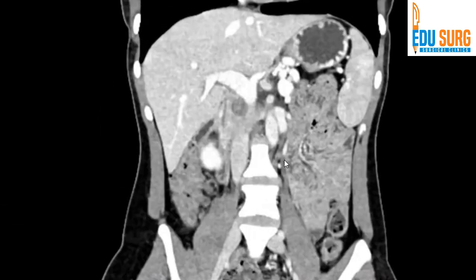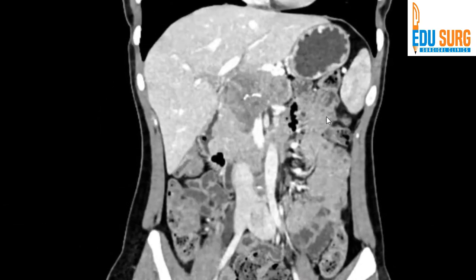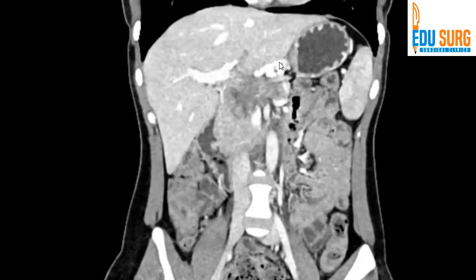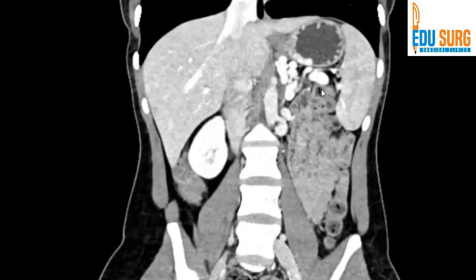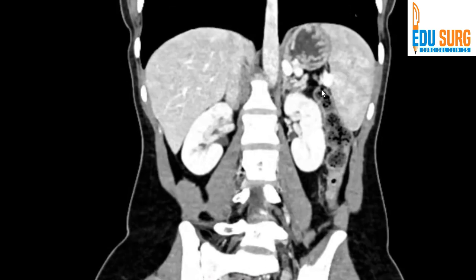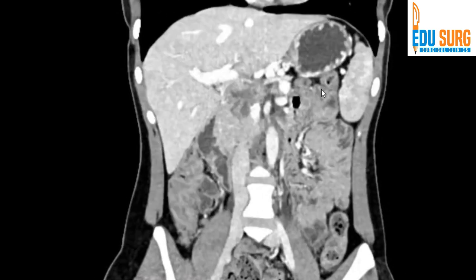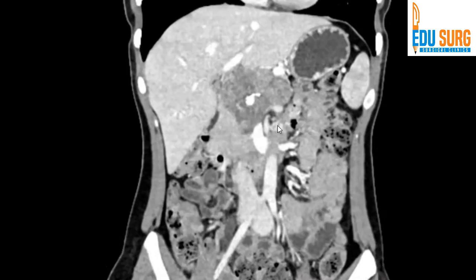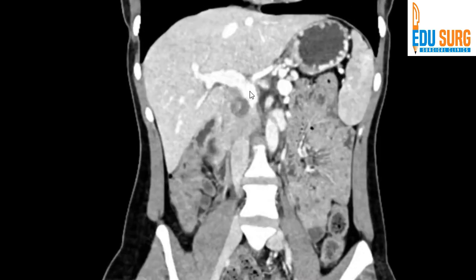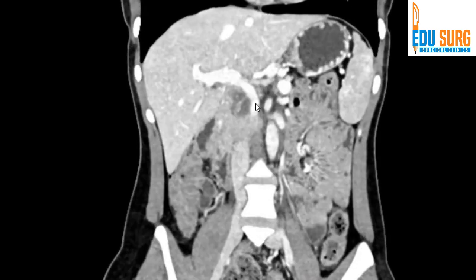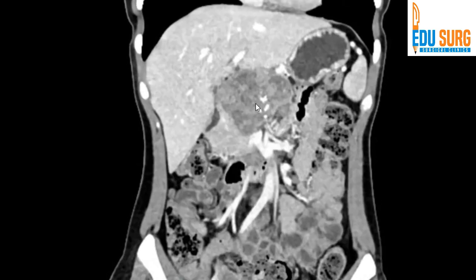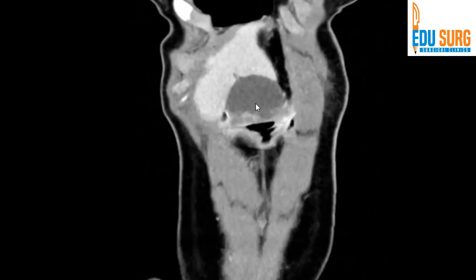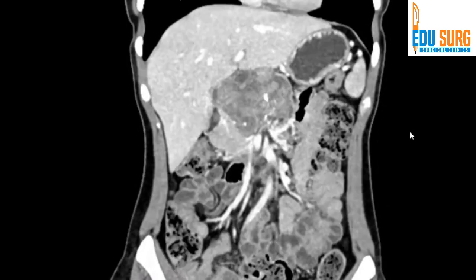We have seen the coronal section. On review, you can again see a lot of collaterals. The spleen is slightly enlarged, and you can see the entire tumor. You can see the portal vein opening up — these tumors usually compress the portal vein and it can be separated.